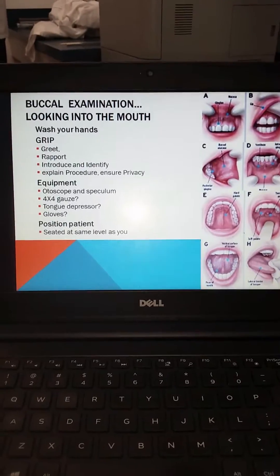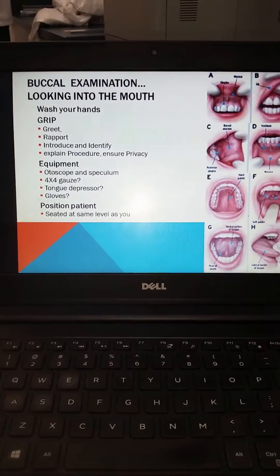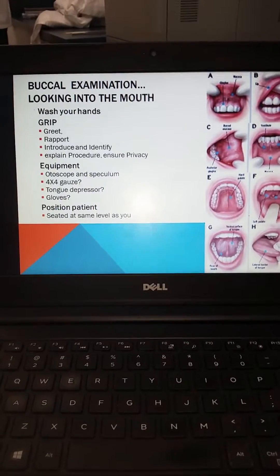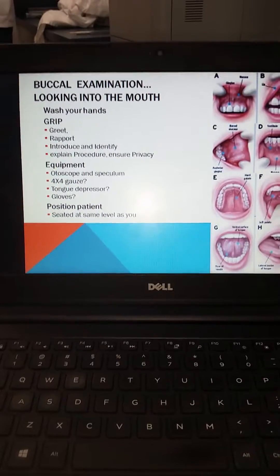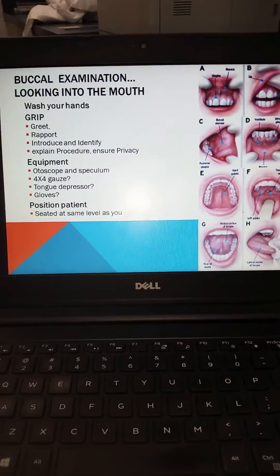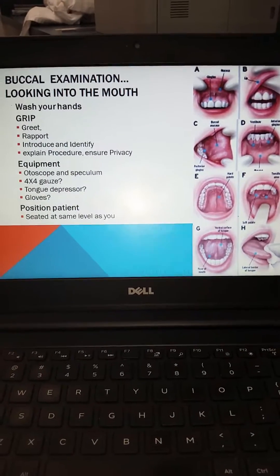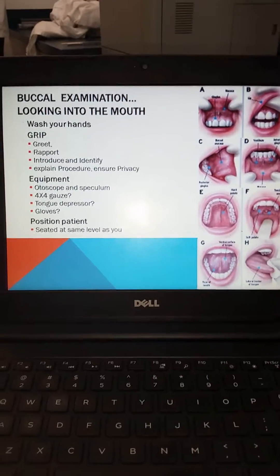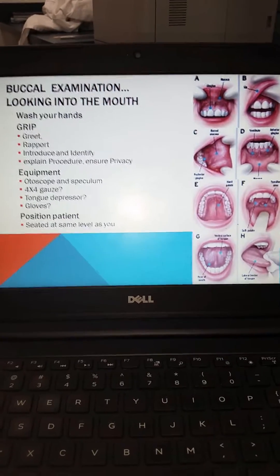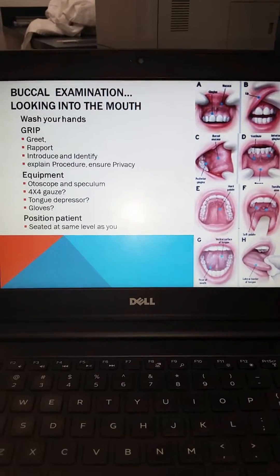For the buccal examination and looking into the mouth, remember your GRIP mnemonic: greet, establish rapport, introduce and identify, explain the procedure, and ensure privacy. You're going to be using an otoscope, speculum, possibly a pen light, a 4x4 gauze if you need to move the tongue out of the way, and a tongue depressor. Because you are going to be operating around the patient's mouth, wearing gloves would be a good idea. The patient is seated at the same level that you are, just as we did with the nasal examination.